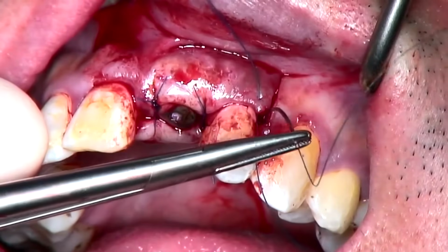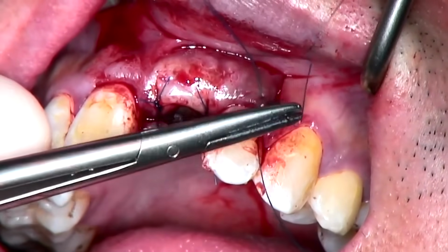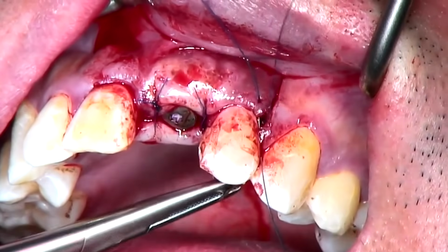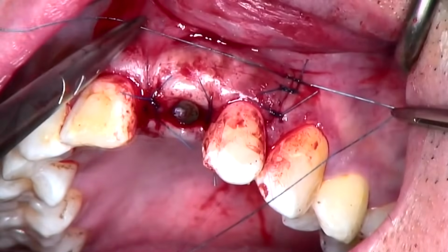The release incision is closed with one suspension suture at the tip of the flap and two single interrupted sutures in a more apical position.